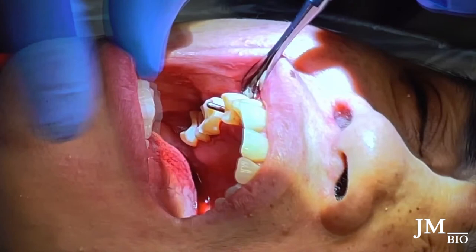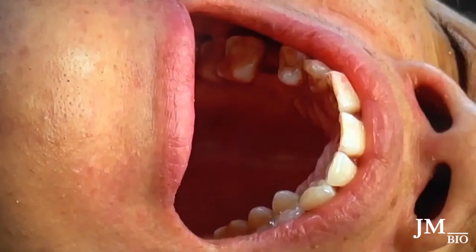I go to the next drill and go down to depth — I think it's a 4x10 that I'm placing. I go to the 10mm depth for the next drill, and then we'll place pretty soon.